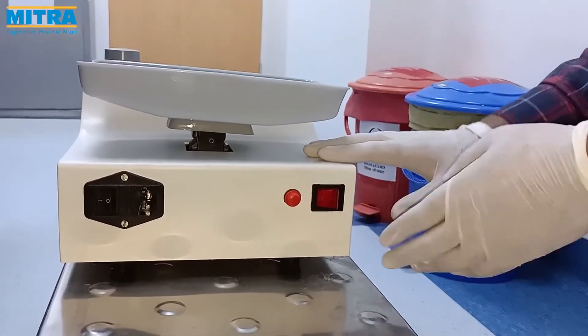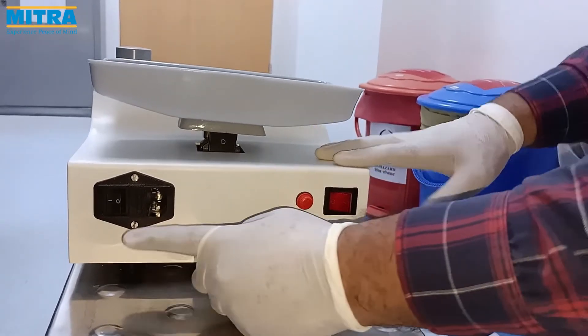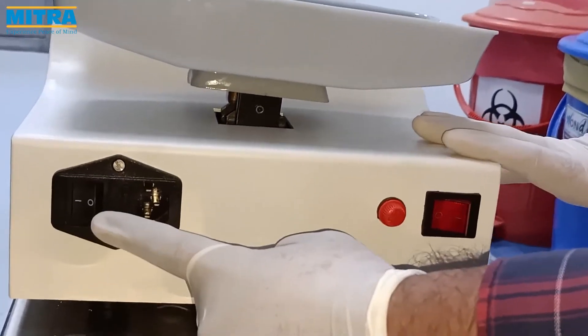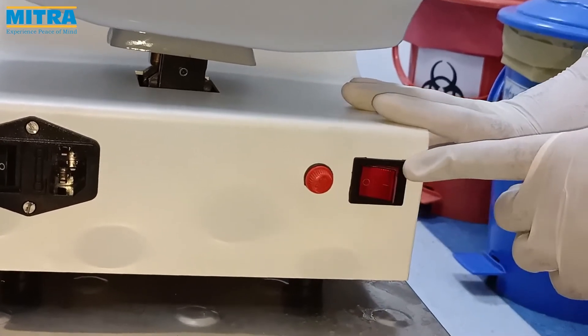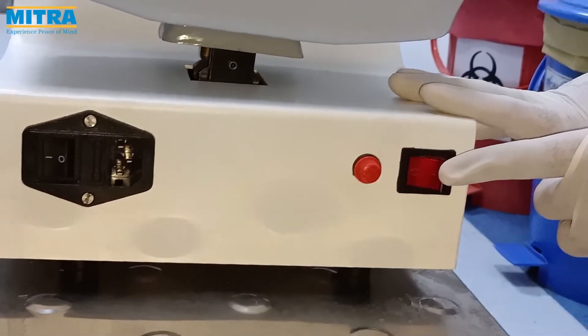This is the rear portion of the device. Here you can see the power socket, main on-off switch, a fuse, and battery operation switch which illuminates as we power on the device.